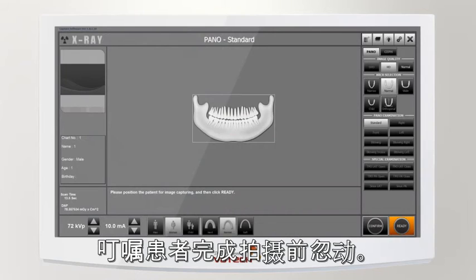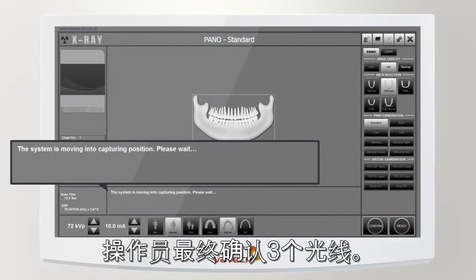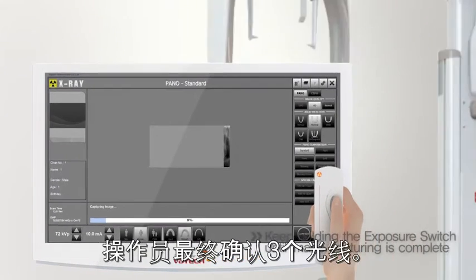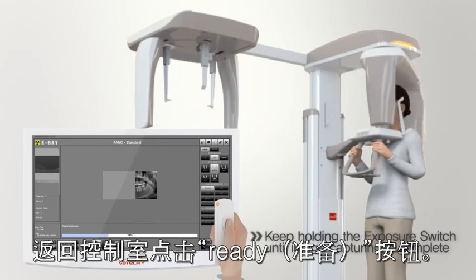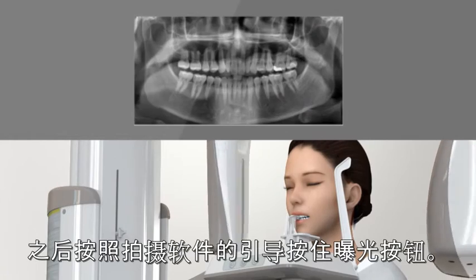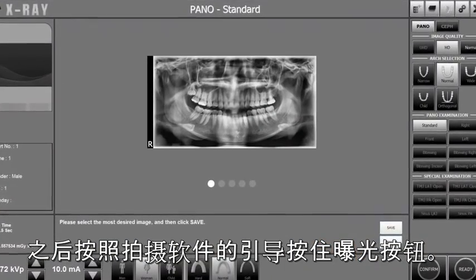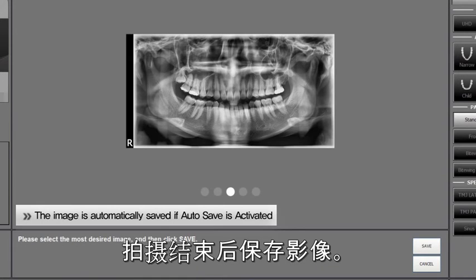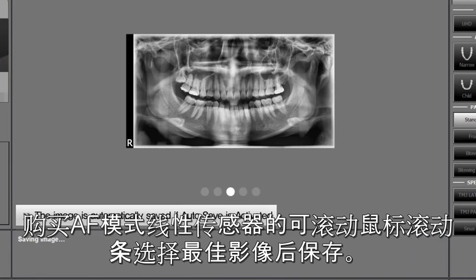Go back to the control unit and click the Ready button. Press and hold the exposure switch as guided in the capture software. While the exposure switch is held, radiation is exposed and the images are taken. After the image acquisition, save the captured image. If you purchased a license of AF mode, select and save the optimal image using the mouse wheel. If the manual save is set, click the Save button to save the image.